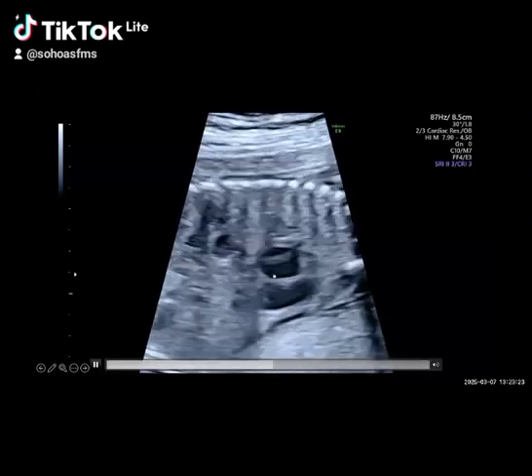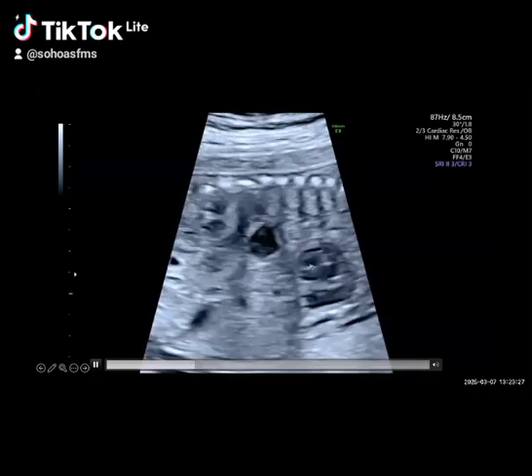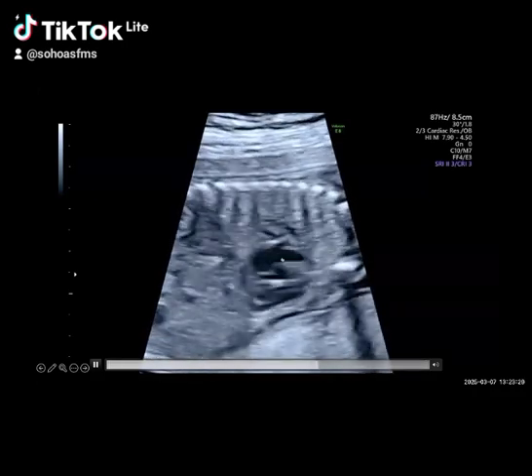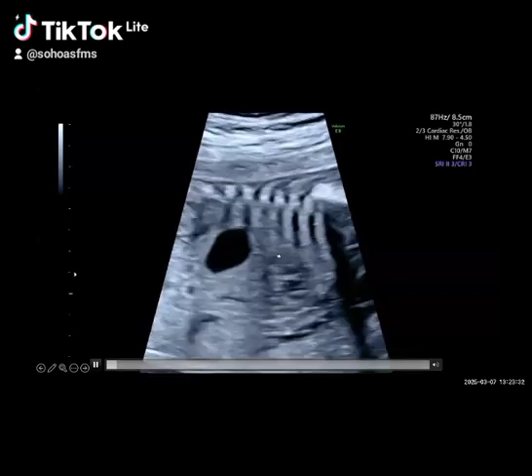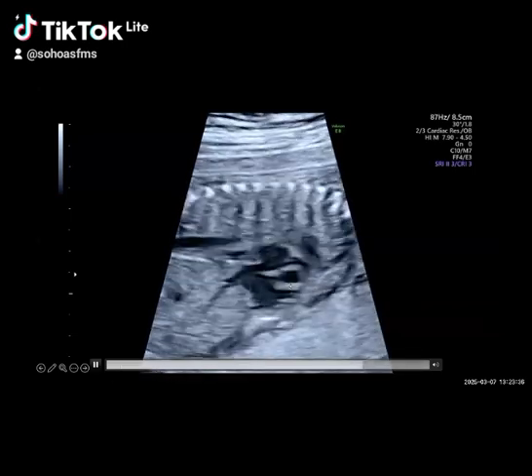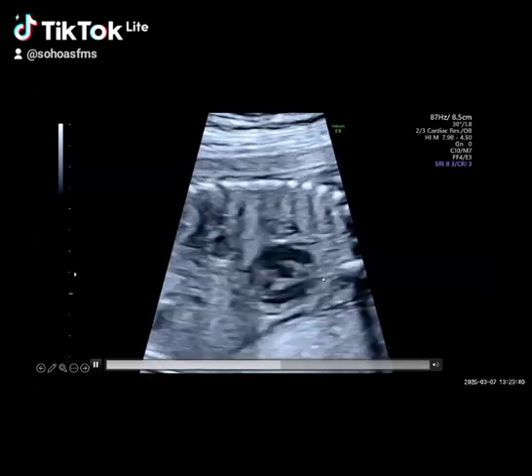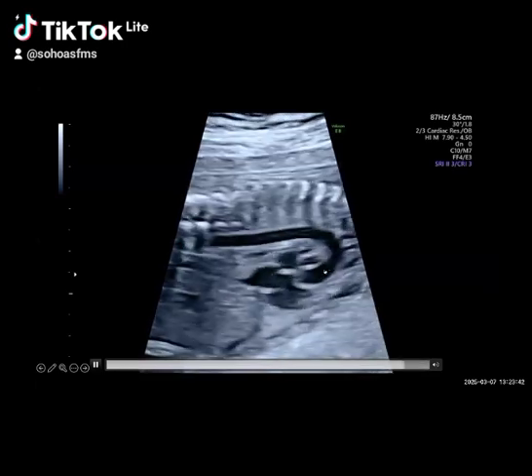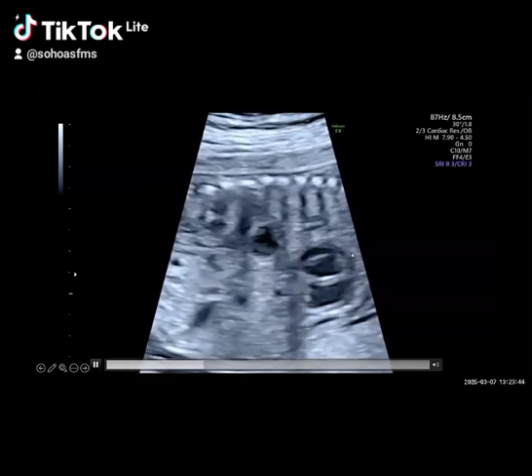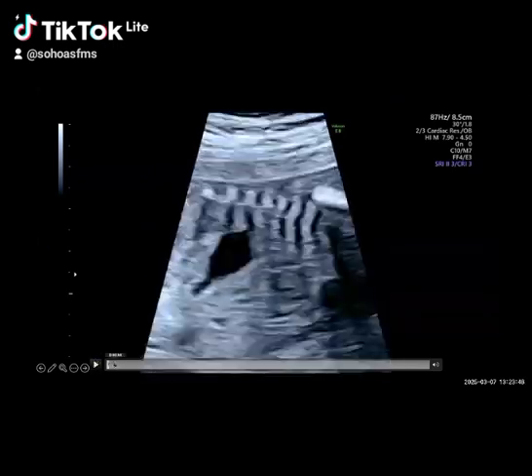The dominant ventricle in this clip is the left. We can see the two papillary muscles. There is a mitral valve which is bileaflet, so there is no trileaflet AV valve, no cleft. There are normally spaced papillary muscles, no disproportion. Without color, I don't see any ventricular septal defect. We have a nice and widely open RVOT, and then we have a beautiful, good size aortic arch with normal spatial relationship between the branching pattern.